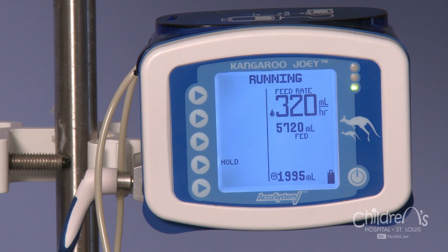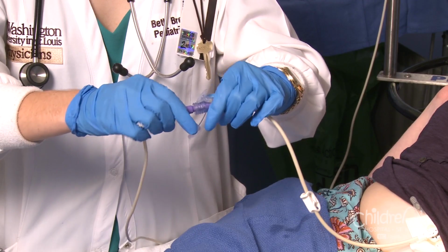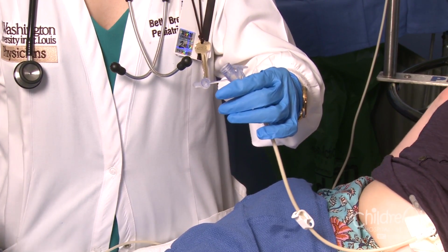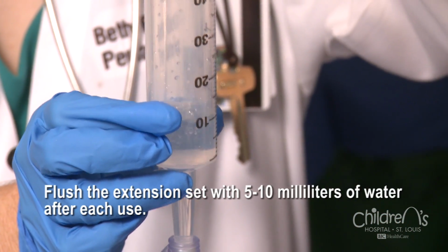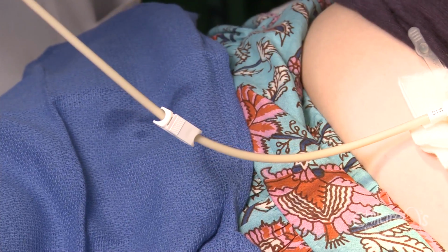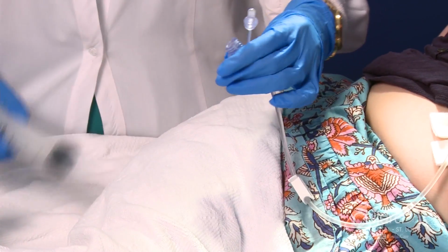At the end of the feeding, clamp the extension set and turn off the pump. Remove the pump tubing from the extension set. Attach the feeding syringe to the extension set. Pour 5 to 10 milliliters of water into the syringe. Open the extension set clamp and allow the water to flow in, and then clamp the extension set. Then remove the extension tubing and close the button.